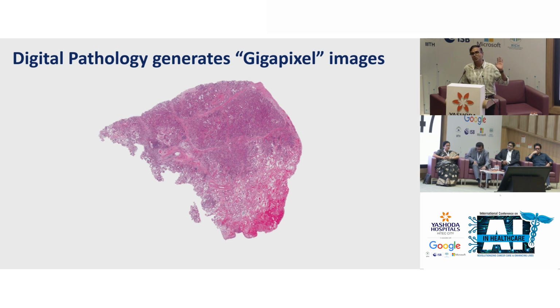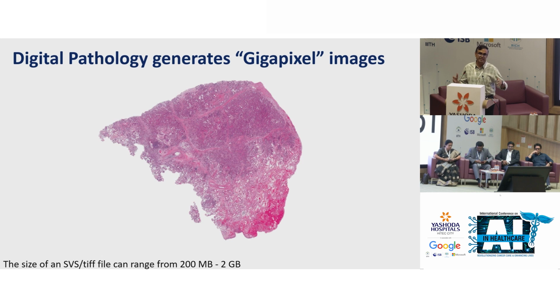You have to go over the entire tissue image and try to come up with a diagnosis which will be used in treatment planning and management of the patient. But interestingly, these images are not easy to handle because they are of large size. As we talk about the technology, I also talk about the infrastructure. Do we have the resources to store and process these kinds of images? And if you are talking about remote diagnosis, do we have the capability to send images across the internet? You can think about several such problems once you start inheriting different technologies in this space.